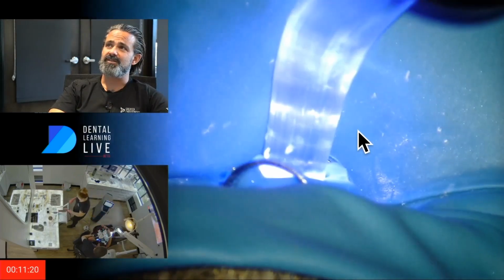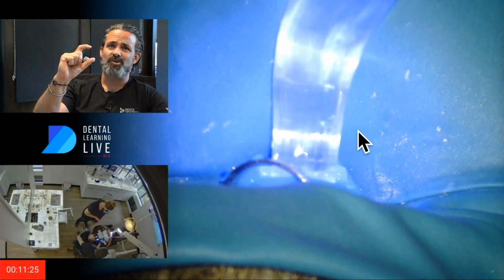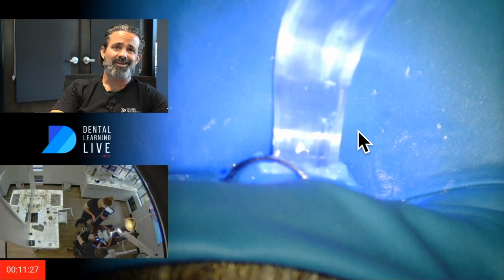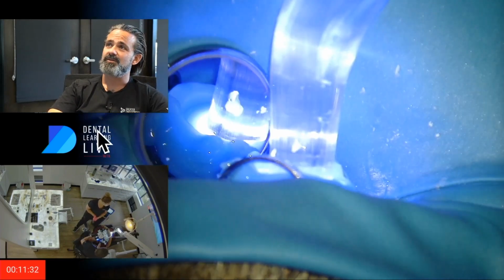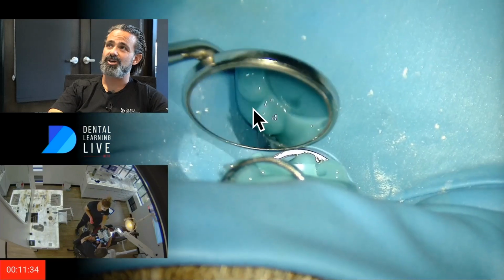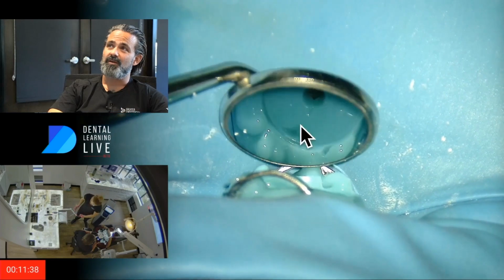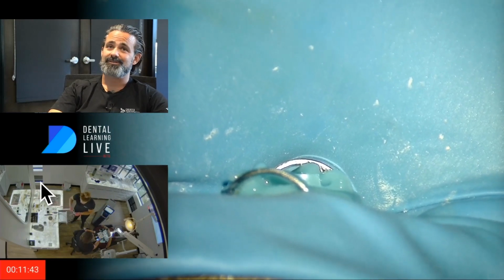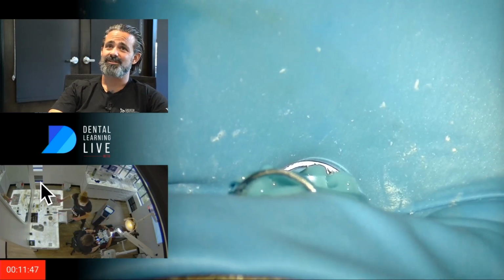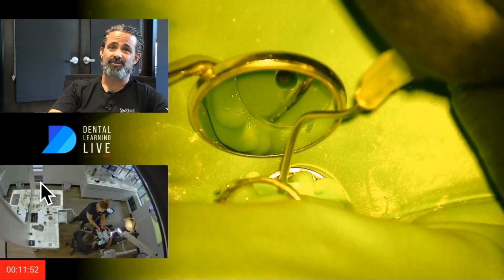And then once I've done that, I always do a final cure right on the occlusal table, especially since I've stovetopped this thing. So I'm going to let this puppy just get hot and set. And you can see I've got a nice ring around the collar, a nice little impression. But there's a void. So let's see what I do here, or not. You could probably get away with that, but I don't like probabilities very much. Never liked statistics much. No probabilities, so we can just add to it.